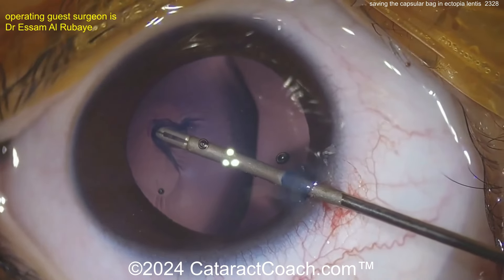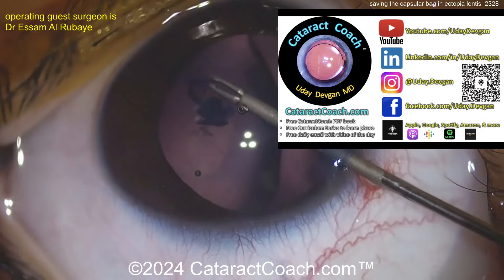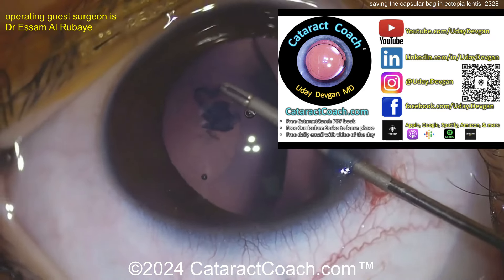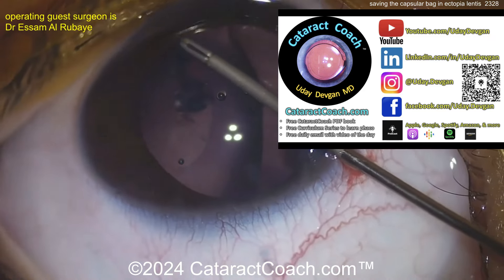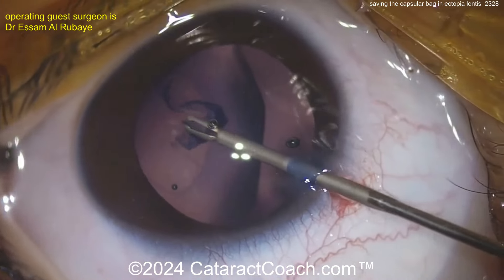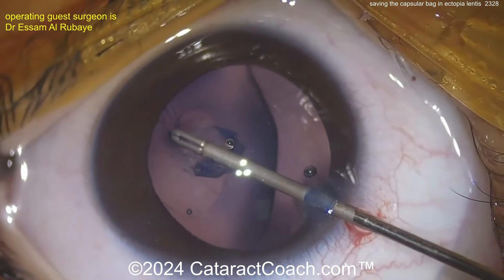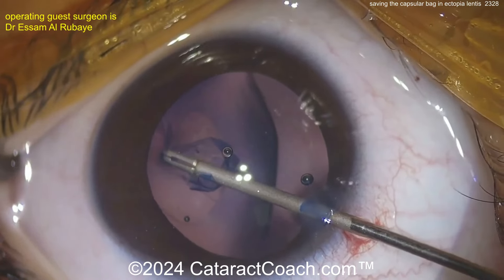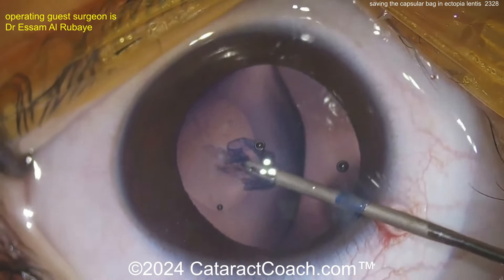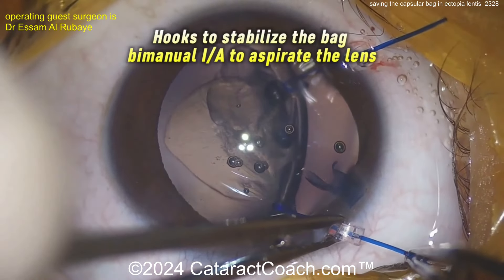Finishing up the rhexis here, taking your time — it's not easy. Look at all the wrinkles there; that indicates a challenge. Finally completing the rhexis — this is the hard part of the surgery. It's not like there's nuclear density or that you need to know how to do phaco chop here; the lens is butter soft. In this case, the surgeon is going to save the capsular bag.